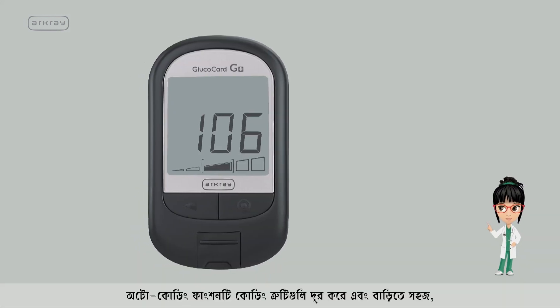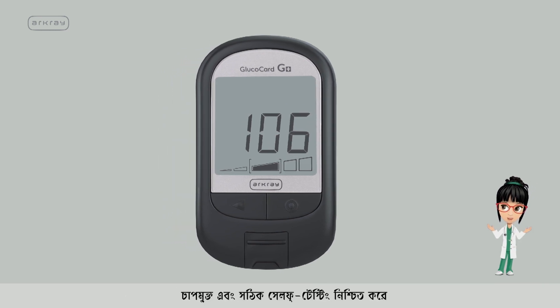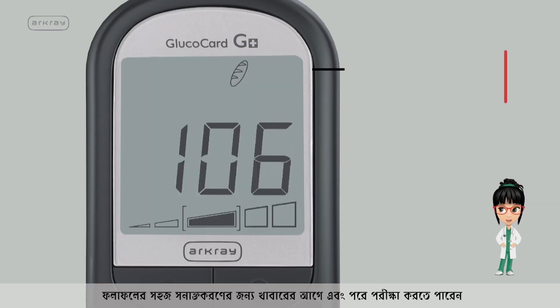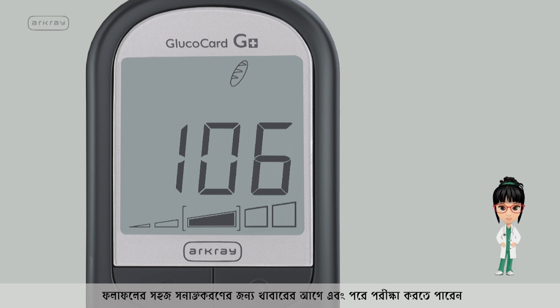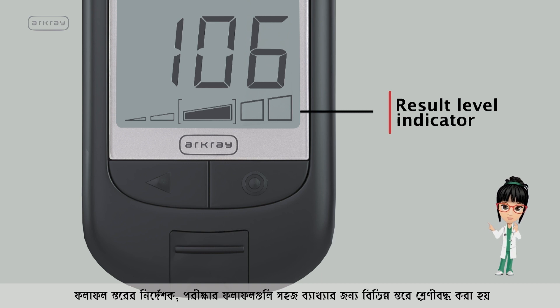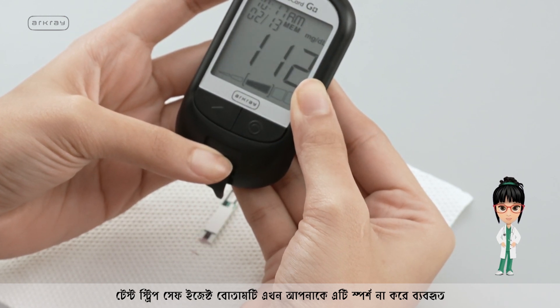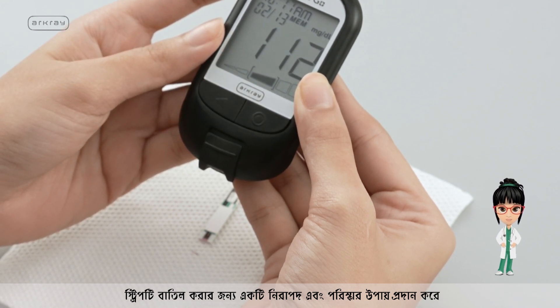The autocoding function eliminates coding errors and ensures easy, stress-free, and accurate self-testing at home. You can flag before and after meal results for easy identification. The Result Level Indicator classifies test results into various levels for easy interpretation. The test strip safe eject button offers a safer and cleaner way to dispose of the used strip without touching it.